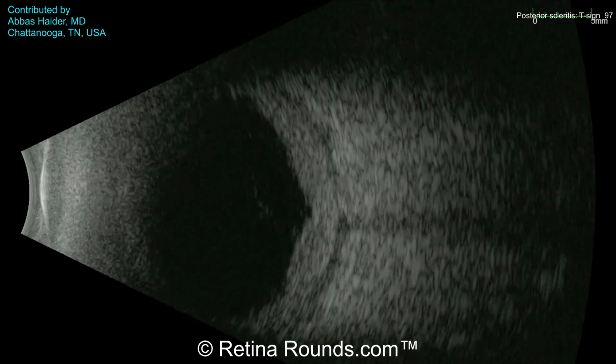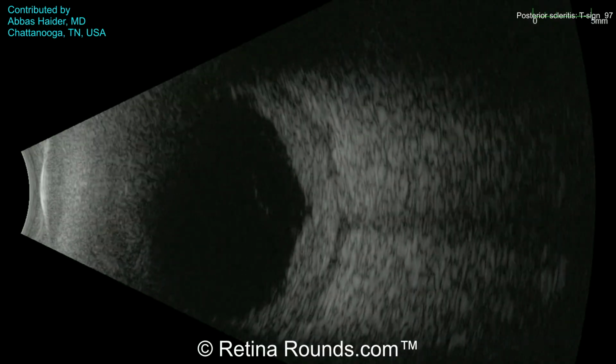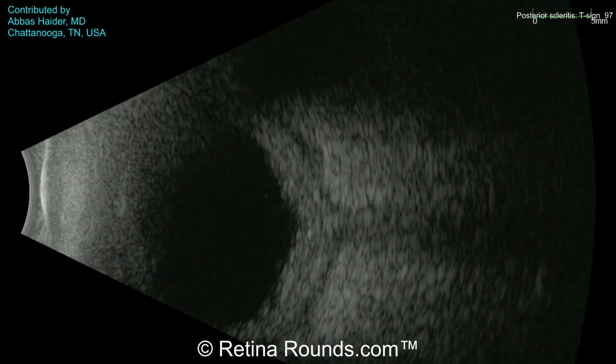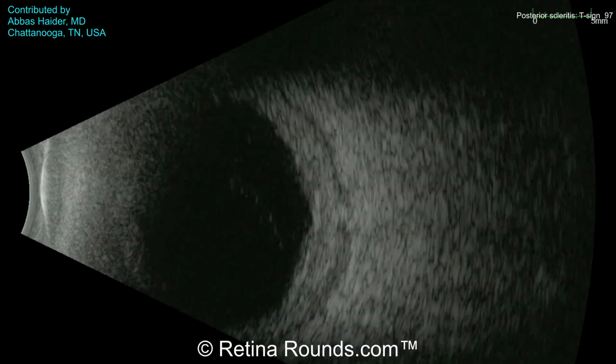Okay, so let's take a look at this B-scan, and first you'll see that it is an axial scan since the shadow of the optic nerve is in the middle of the ocular image. The ultrasound probe is being moved in a limited fashion laterally to bring the optic nerve into view, and the most pathognomonic finding of posterior scleritis here is the so-called T-sign.